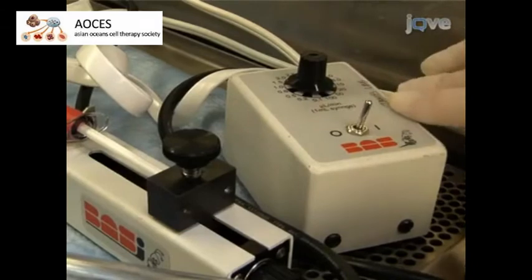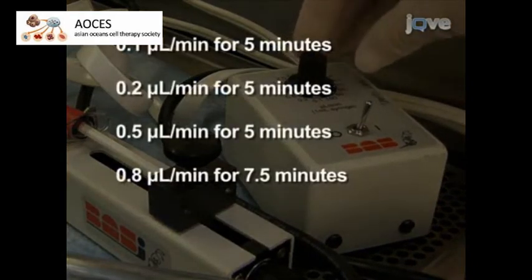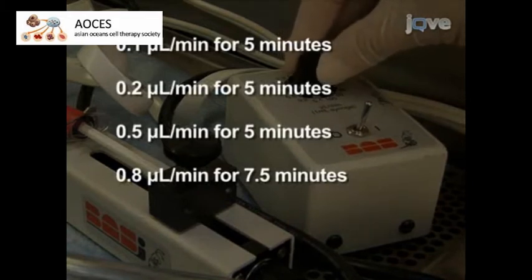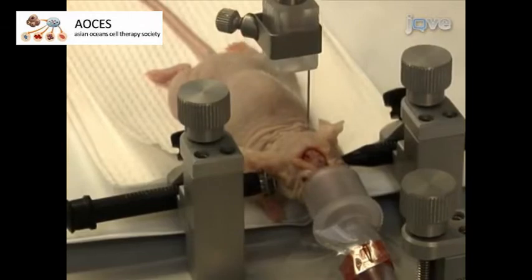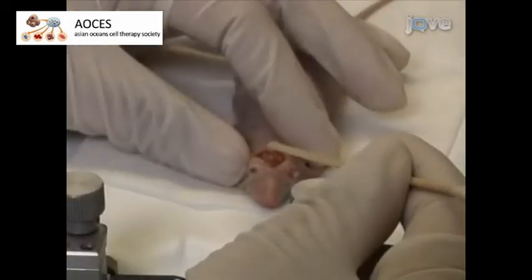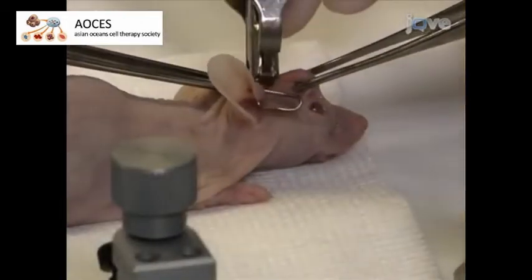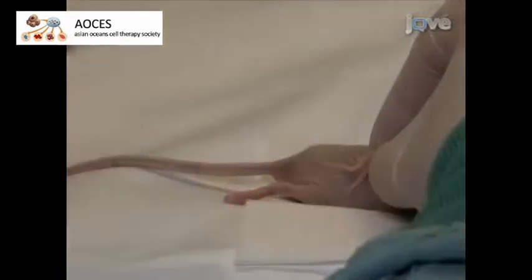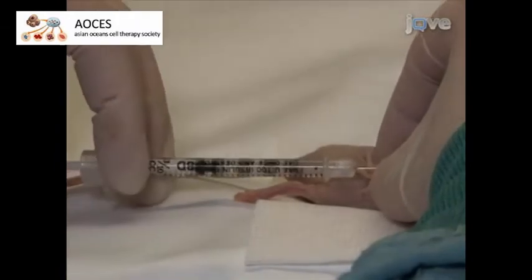Begin the infusion by turning on the syringe pump using the rates and durations shown here. At the end of the infusion, slowly remove the cannula and swab the skull with 3% hydrogen peroxide. Apply sterile bone wax to the hole. Using forceps, draw the skin together and staple to close. Administer buprenorphine subcutaneously for post-operative pain relief.